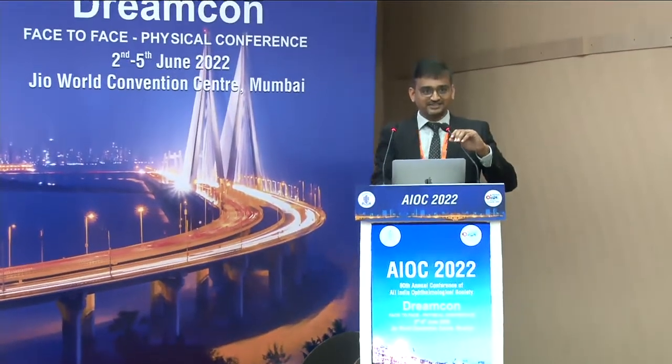Good morning, everybody. So I'm going to go through a little bit of basic evaluation as far as the Pentacam is concerned. And I think everybody will agree with me that it's the most widely used, widely studied, and widely accepted modality of pre-Lasik assessment. It's almost become a gold standard. You need to have a Pentacam-fit patient to actually go for the Lasik. Now, how do you evaluate the Pentacam in your busy clinic? So you may have a Pentacam, or you may order it.